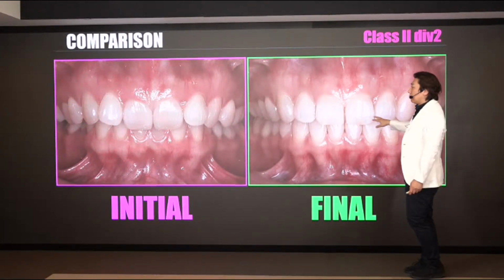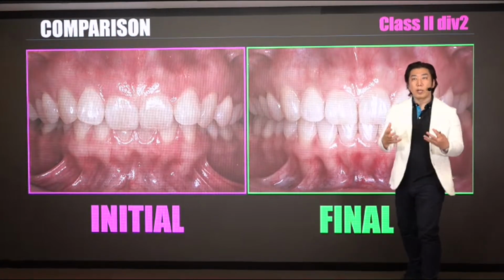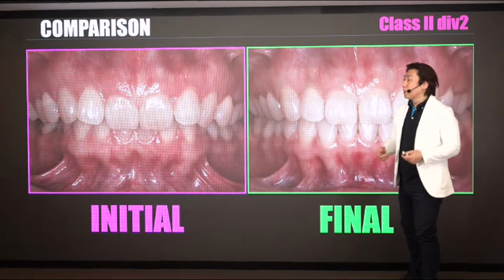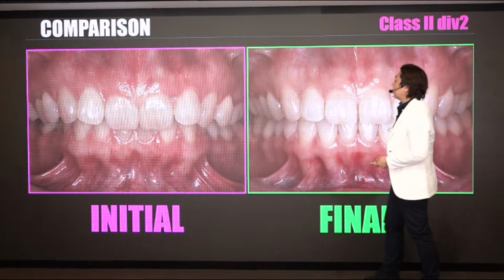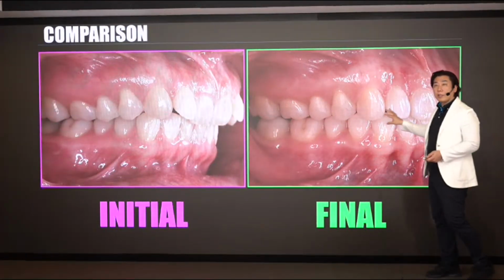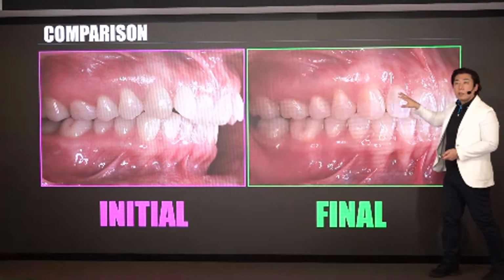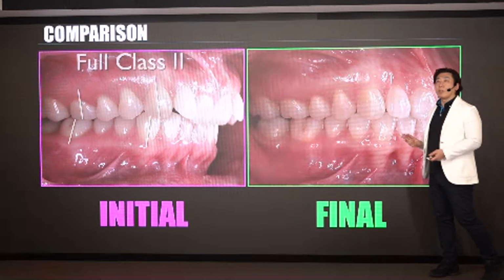This is a comparison of initial and final. Initial and final, totally different. Not only AP correction. This is vertical control, alignment, and the guide, everything. Here is the initial and final, the class 2 position, then this is the class 1 relationship.